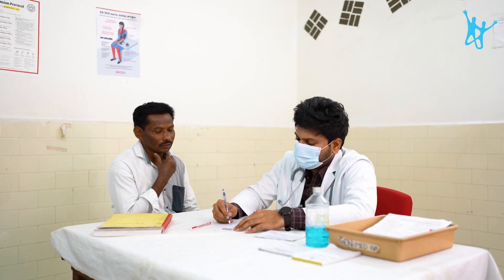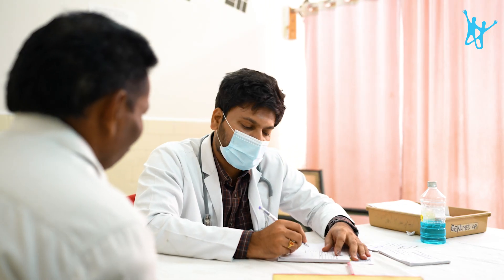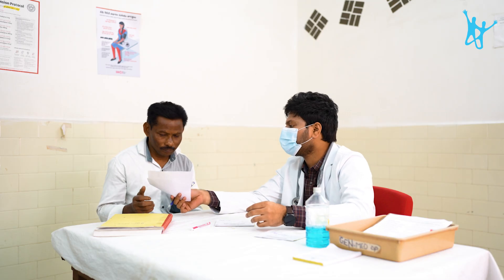The doctor studies the symptoms. It might be a bacterial fever, influenza, or TB. To be sure, he decides to run a test before prescribing any medicine. If it is a major condition, it can after all get more complex.